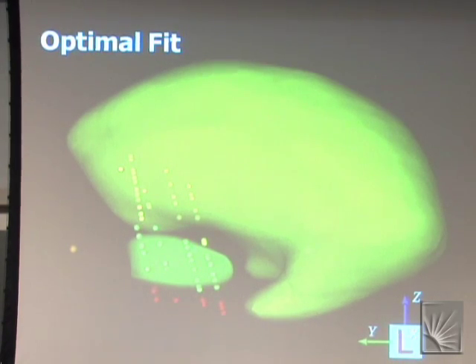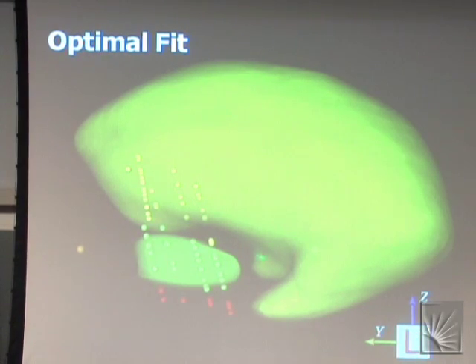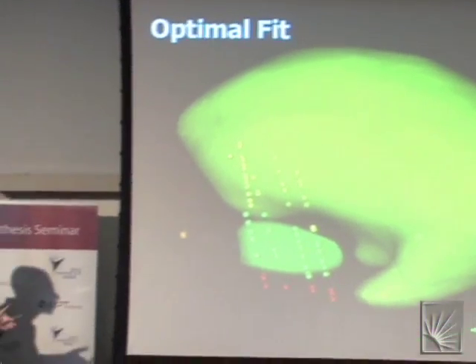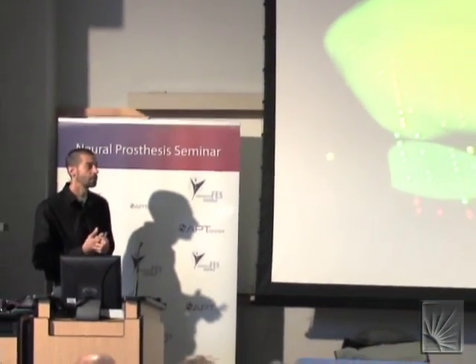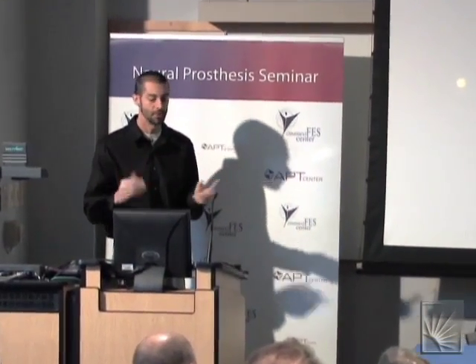So why would you want to go through all of that? It seems like a hassle. If you got the MER data, then you can see where the subthalamic nucleus is. Well, nowadays they do multiple passes, several; 3 is about the average, at least at the Cleveland Clinic. Well, maybe we don't need to do as many passes with the microelectrode. Every time you poke that sharp little needle down there, who knows what might happen.